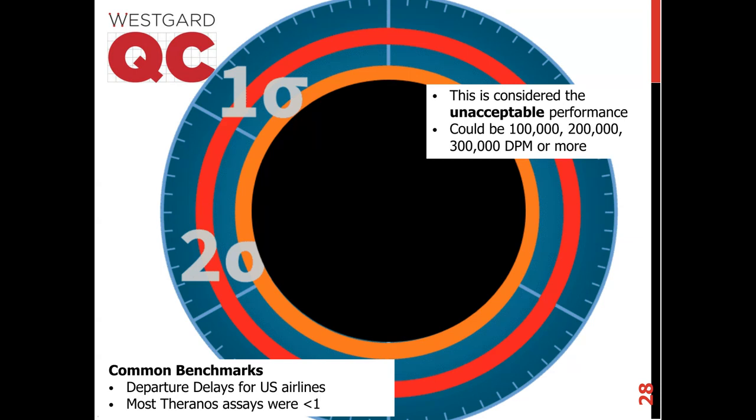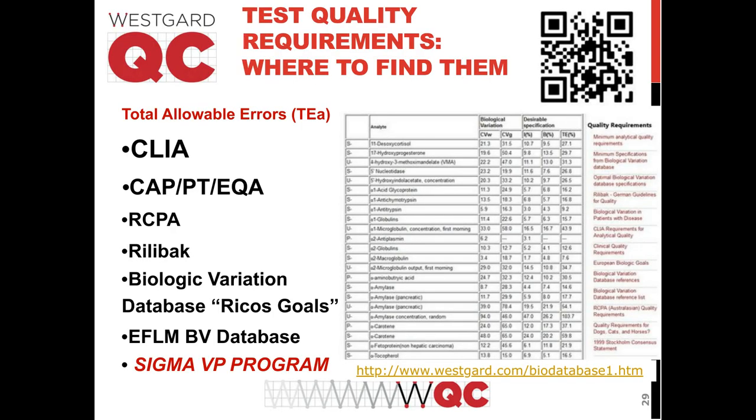And then, one slight footnote, we know the Theranos trial is beginning, or I should say the trial of Elizabeth Holmes, the former head of Theranos, and what's one reason why her $9 billion valued company went to $0 valuation? Because most Theranos assays were below 1 Sigma. So now we understand a little bit about the different positions on this 6 Sigma scale.